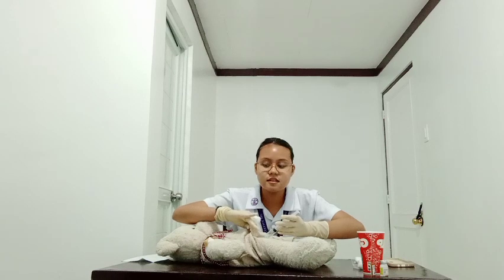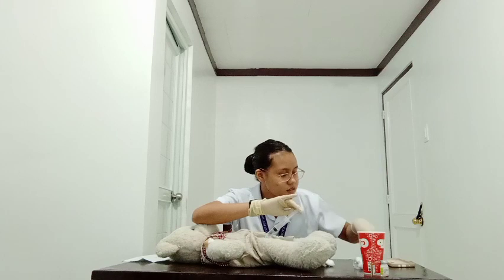When the needle is inserted, move your non-dominant hand to the end of the plunger. Some nurses find it easier to move the non-dominant hand to the barrel of the syringe, and the dominant hand at the end of the syringe. Okay, just like here. Oops. The needle cap fell off right away, I'll be using another one.